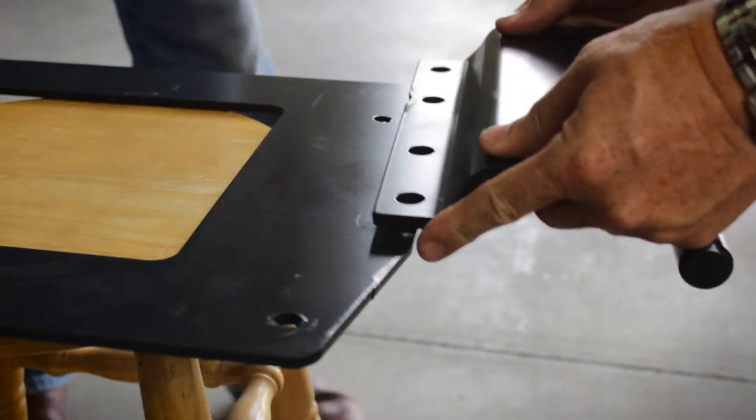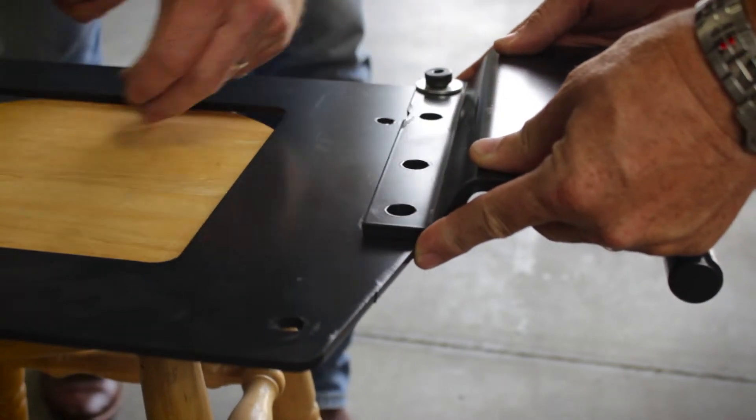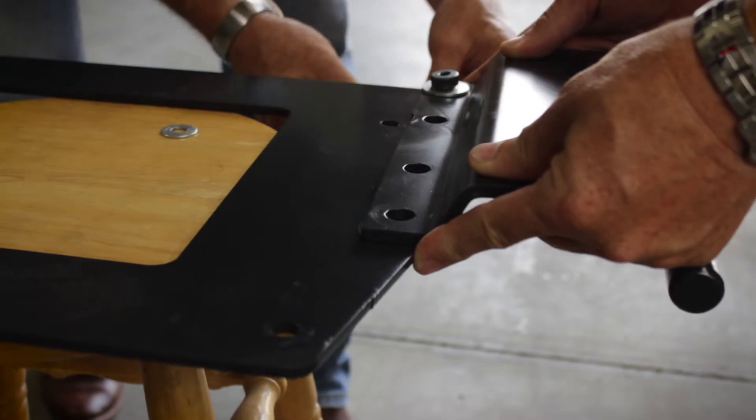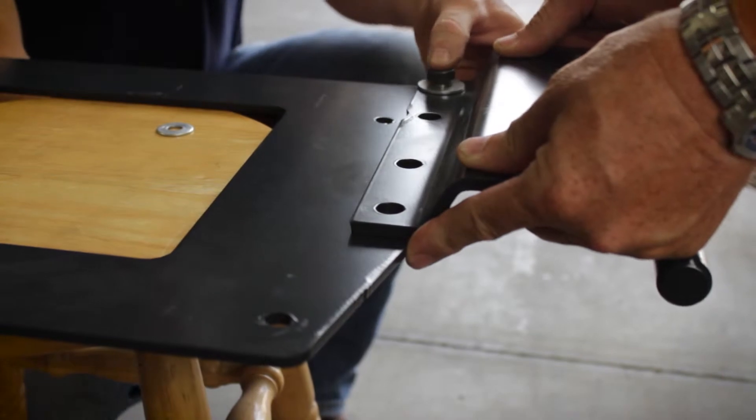The first step for installing your Hightower Docking Station is to attach the side bracket frame to the main frame bracket. B&D recommends doing this before installation to the frame to prevent wheelchair components from interfering with the installation itself.